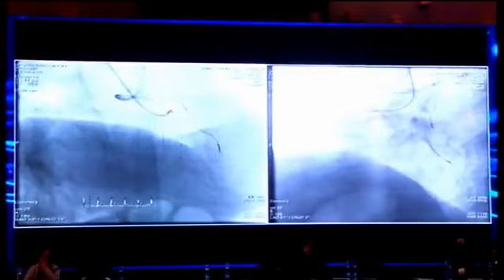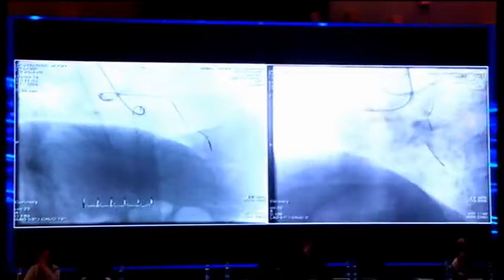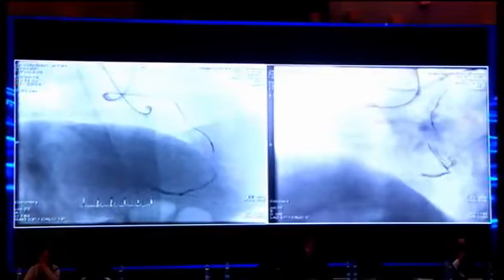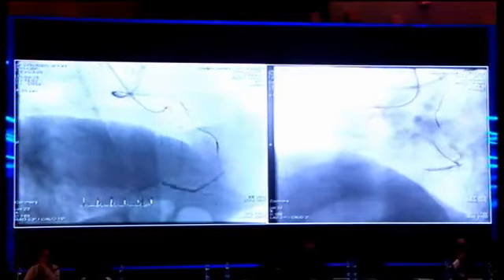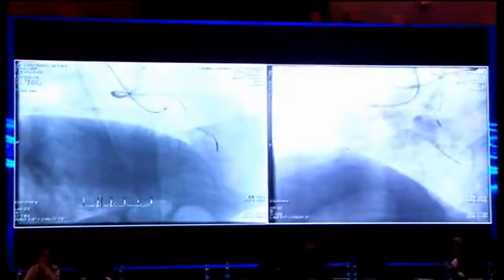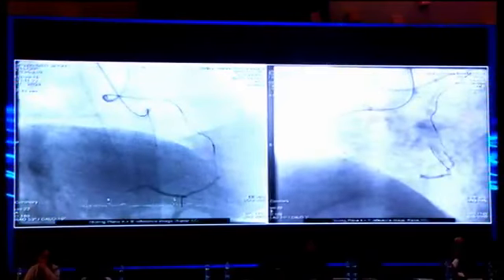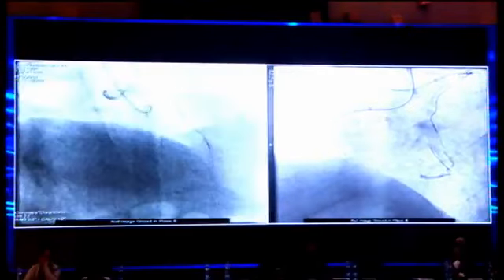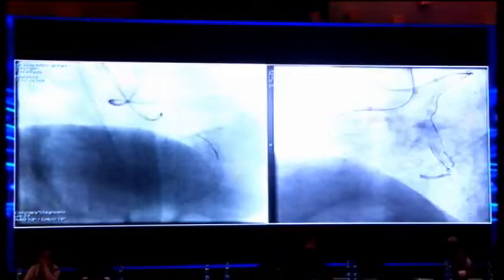So you have a different view now. It is slightly posterior. The main track is going posterior, and then you have to come anterior. So there is a good Z bend there. Stop. It goes a little bit 180 degrees up, unfortunately. It is actually a double U. I think it's going up and then coming down. So let's see.